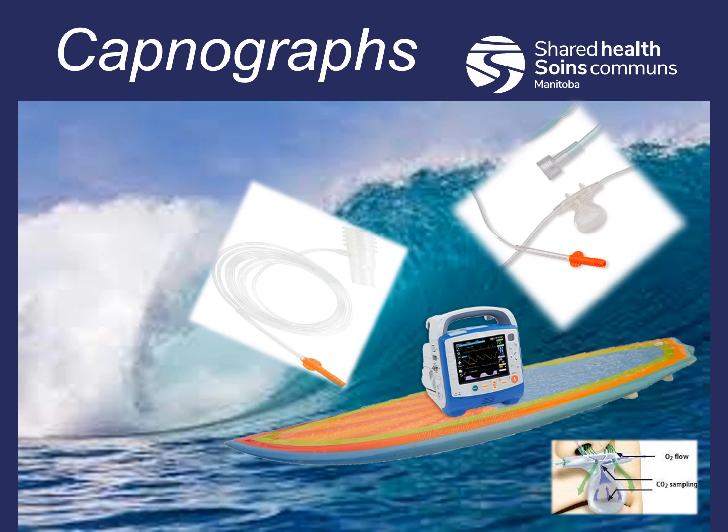A side stream capnograph has the CO2 sensor located in the main unit, which in our case is located inside our ZOLL. And the CO2 is aspirated from a sampling tube connected to a T-piece adapter located between the airway device and the airway circuit, or the sampling line is connected to a nasal cannula device.